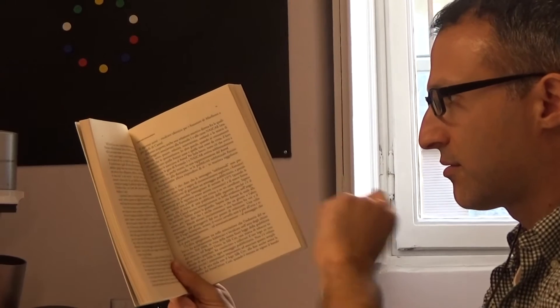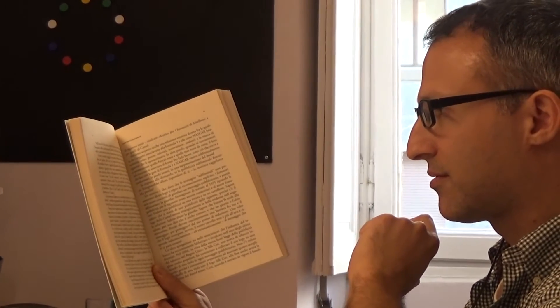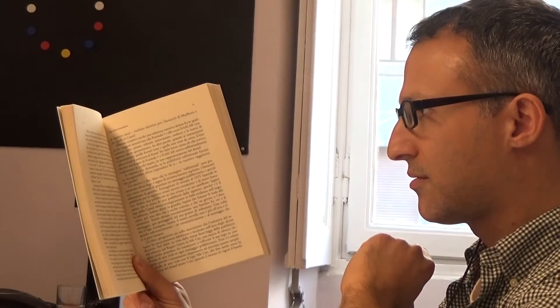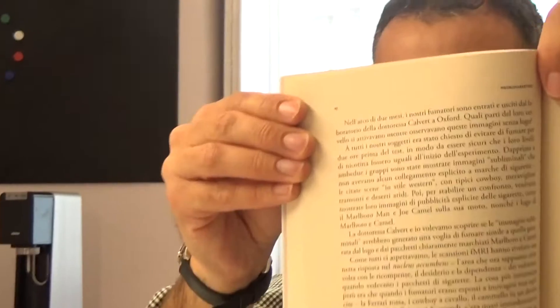OrCam reads any text. Here's a book — I just point my finger and there we go.